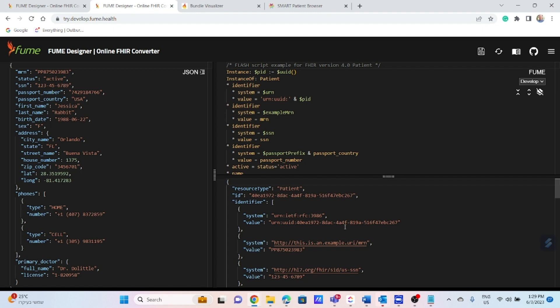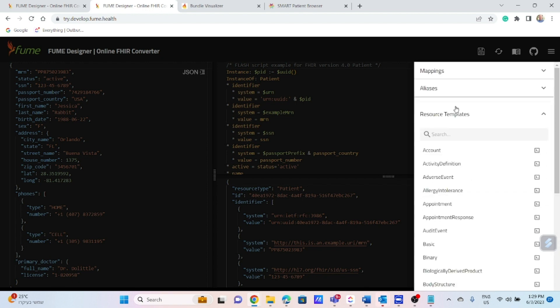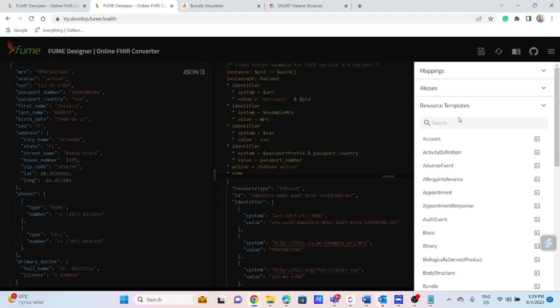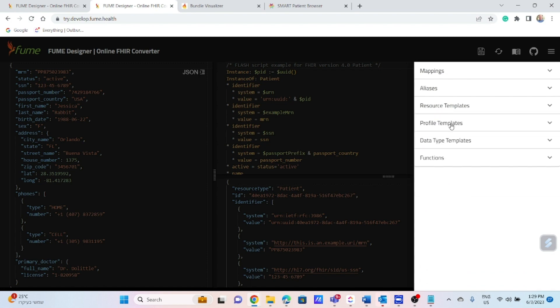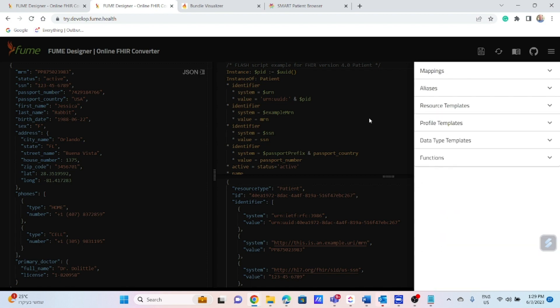The FUME transformation engine uses a Flash syntax developed by Outburn which is based on JSONata and FHIRPath scripts. FUME uses predefined resources and profile templates providing capabilities for easy and straightforward transformation process. You can see the list of all resource templates here according to the standard and the same from profile templates.